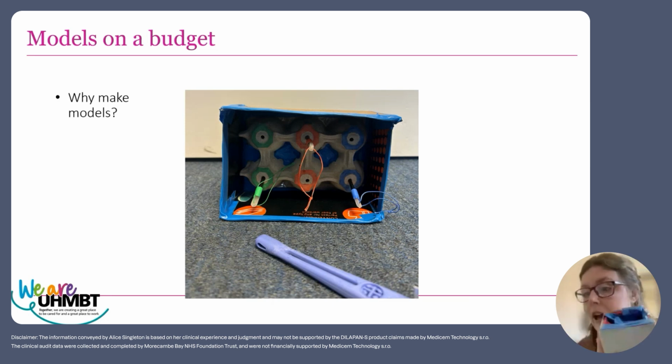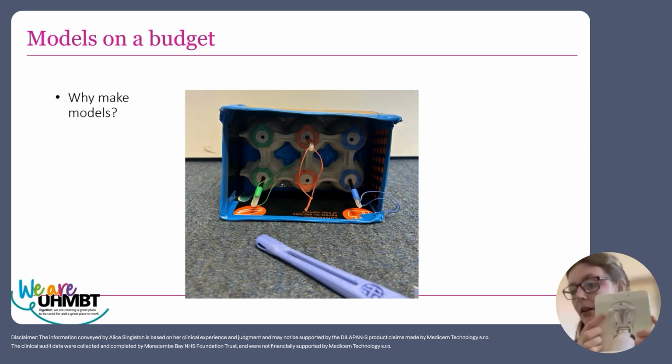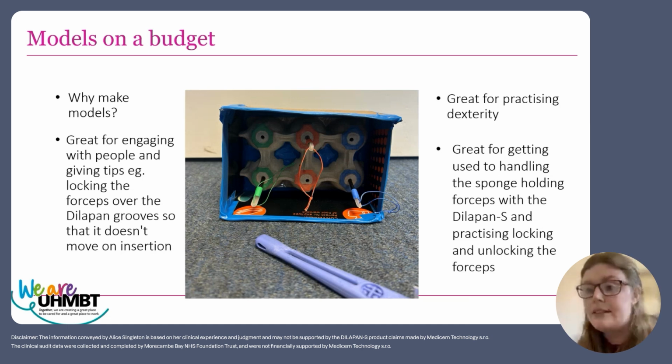The other one I use is this one. It's the same. It's got an egg box at the bottom, but it's got an inflated balloon inside around the outside, so that you can practice using the speculum that holds open the vaginal walls. And then the third one, if any of your consultants do teaching on coils, they let me borrow one of their coil models, which could be really helpful because you can move the cervix out of the way. So yeah, just as a little bit of a tip. Next slide, please, Hannah. So yeah, it's great for engaging, making sure people understand, and dexterity and getting used to handling the equipment. Next slide.